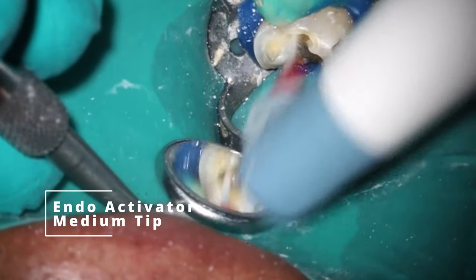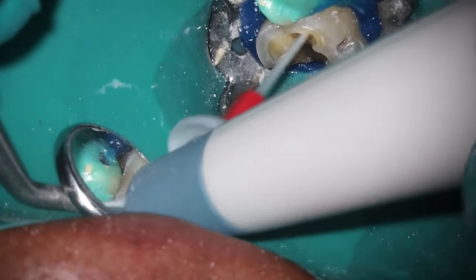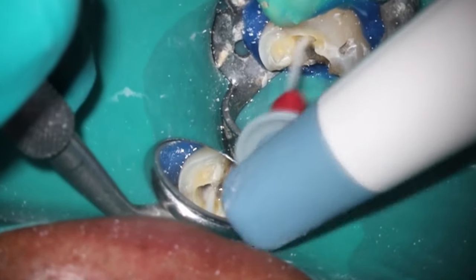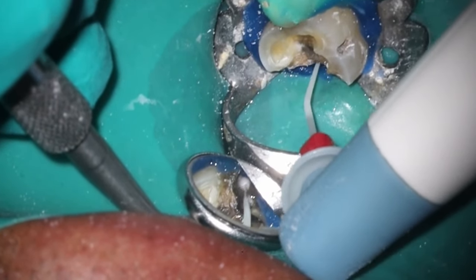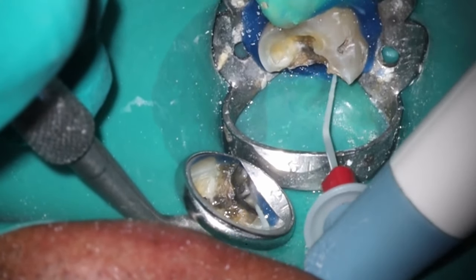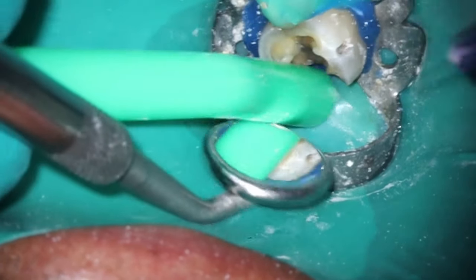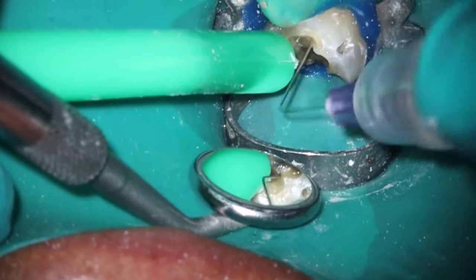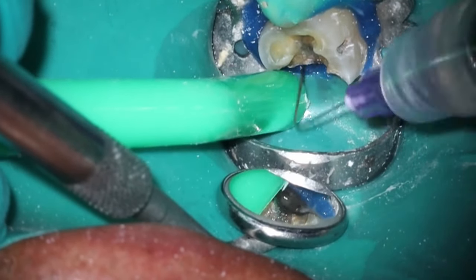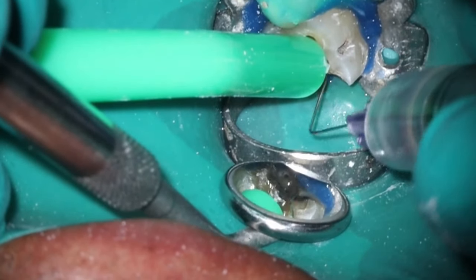If you look back at that x-ray and imagine if I had to connect the distal to the mesial — I would have had a massive hole inside this tooth. Because the existing occlusal restoration was so thin — only maybe a millimeter deep, especially by the time I took it out of the bite — you still have this big wall of dentin inside there, and I want to keep that if at all possible. Going in now with the activator, just like you've seen me do. A decent amount of bubbling tells me there's still a little bit of activity, so we'll rinse it out until we don't see any bubbles — that's my endpoint for getting ready to seal.